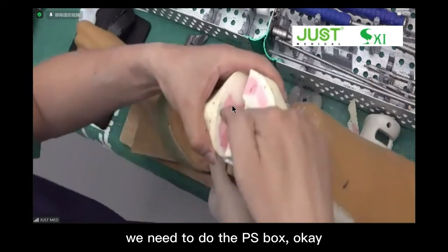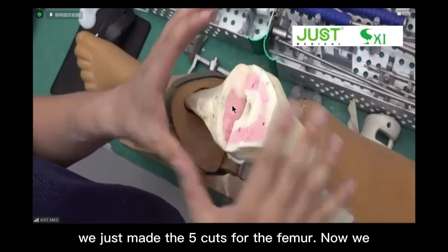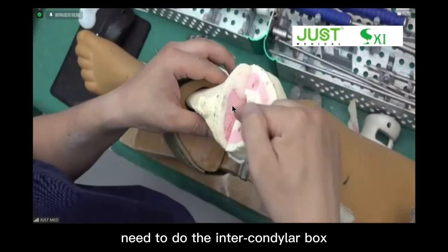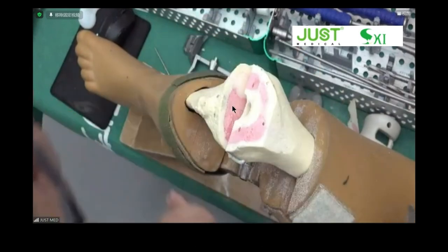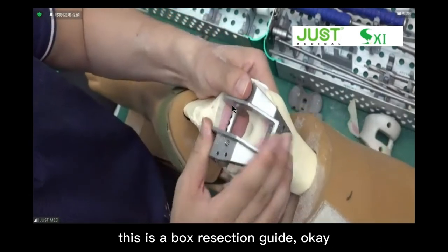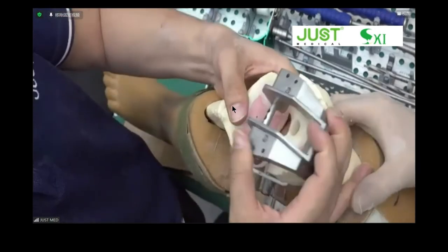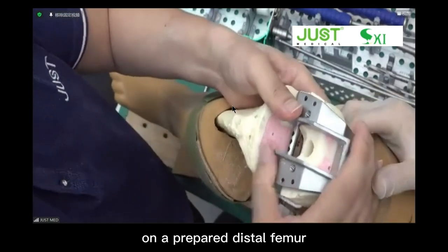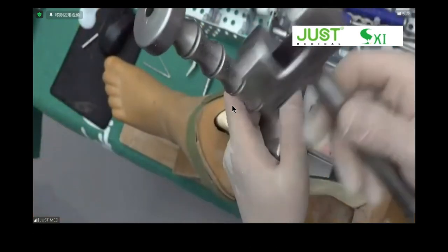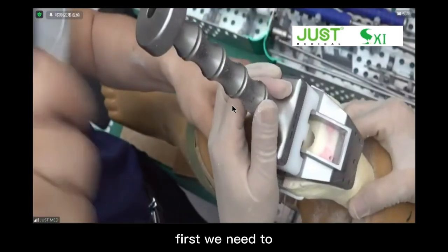We need to do the PS box, okay? We just made the 5 cuts for femoral. Now we need to do the intercondylar box. So you just impact the size-specific box resection guide. This is a box resection guide, okay? On the prepared distal femur, then secure the box resection guide.